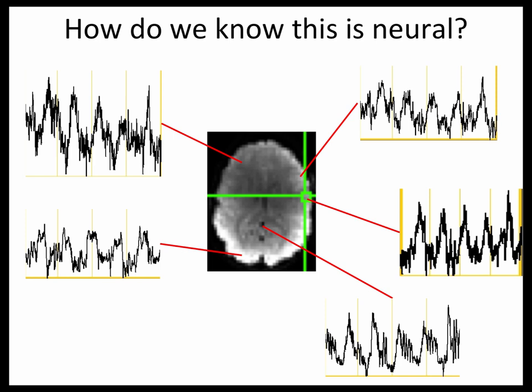The signal we're looking at varies over these 5-second time scales, and those are time scales where repetitive motion could happen. Okay, so that might be one. Something else that jumped out that we didn't know before is that we have the same signal going up and down, but it's happening across the whole brain in pretty similar ways. So suddenly you're thinking, what neural task would show signal in all these different areas and in our CSF again?